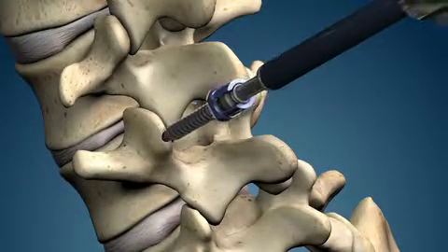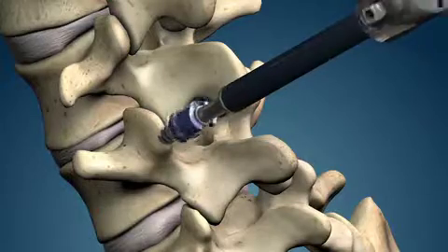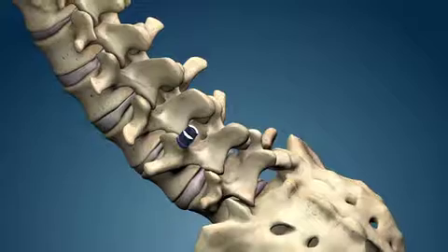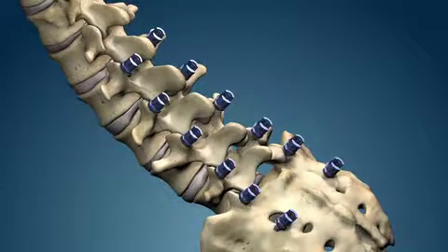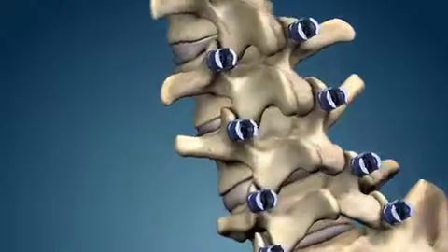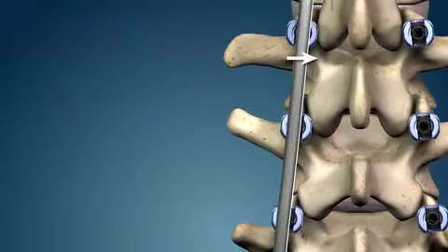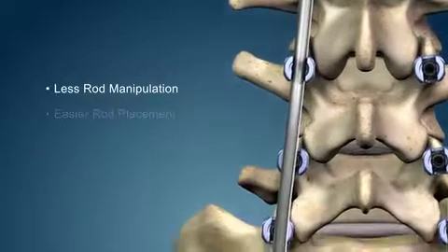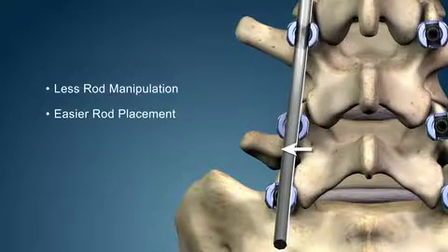Screw placement no longer needs to be compromised to accommodate rod insertion. Translation screw technology allows screws to be placed in the surgeon's preferred anatomic location. The 3 mm of medial lateral screw translation allows for less rod manipulation and simplified rod introduction.